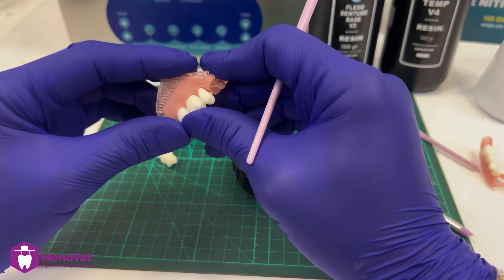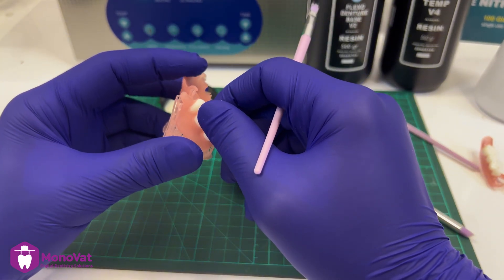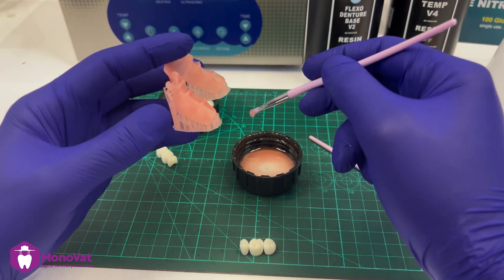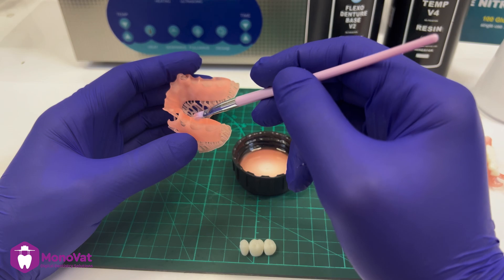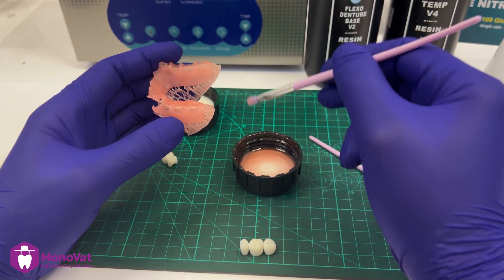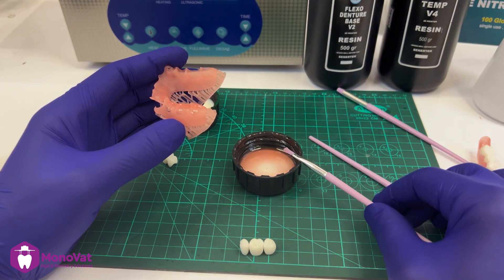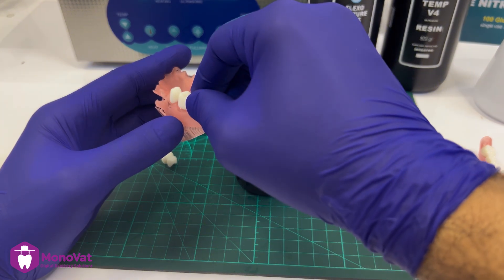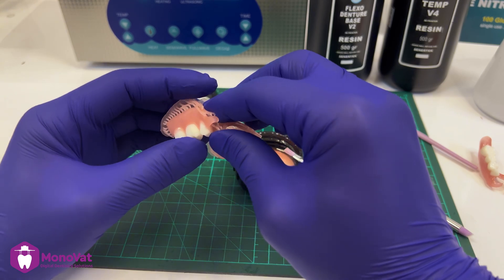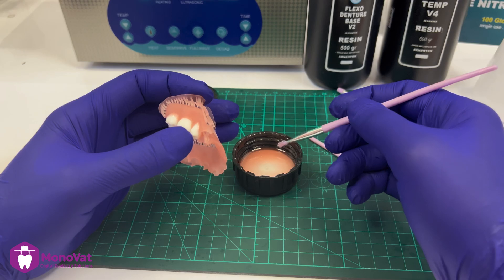Now we will glue the teeth with the denture. First, we should put some drops of the same denture resin in the teeth socket. After that, place the teeth in its gap, then press it with your fingers and remove the extra resin.